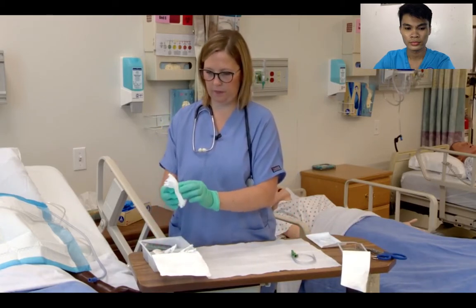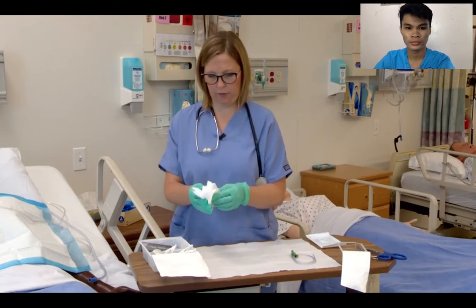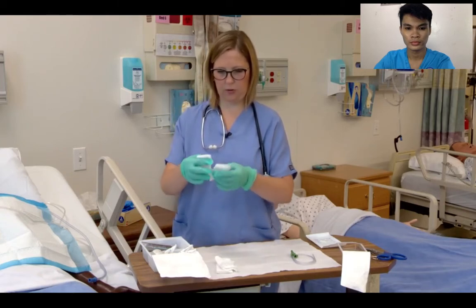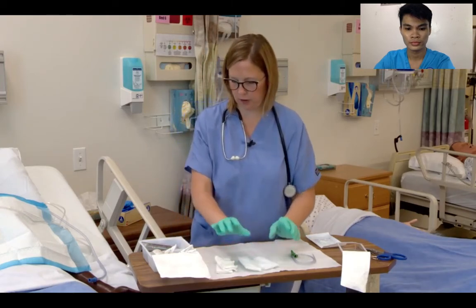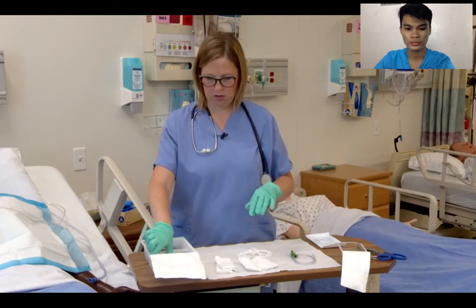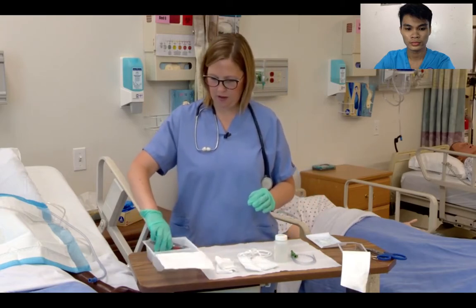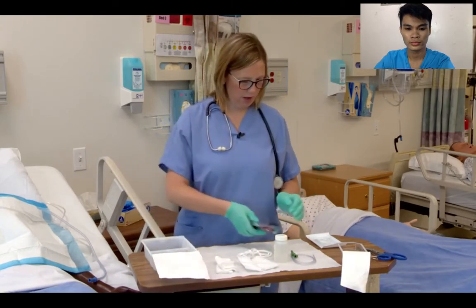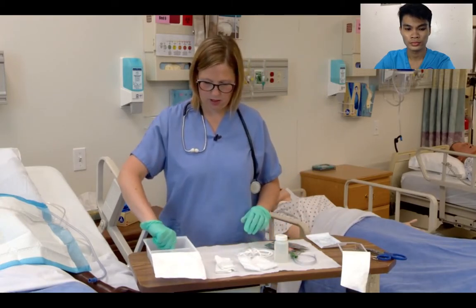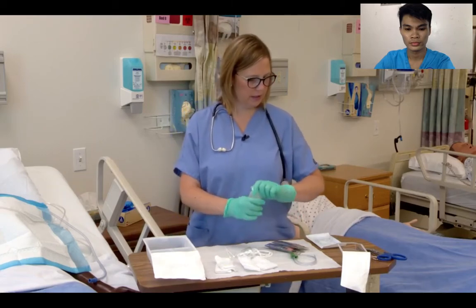My gauze. There's two different types of gauze in here. I've got regular 4x4s and the drain sponges with the slit in it that's going to go around the trach when I'm finished. Got the trach ties. Got our normal saline solution. Packages of hydrogen peroxide, pipe cleaner, and cotton tip applicators. Okay, I'm going to open up the saline now.